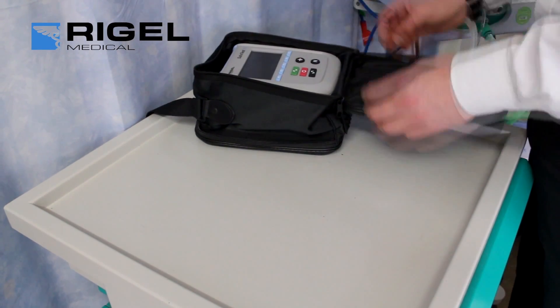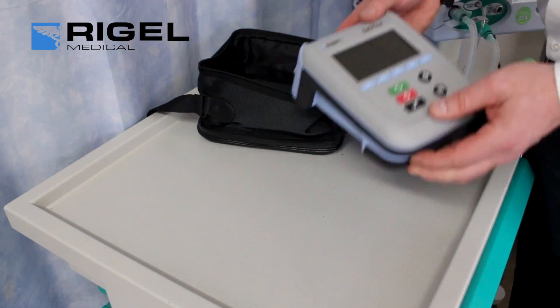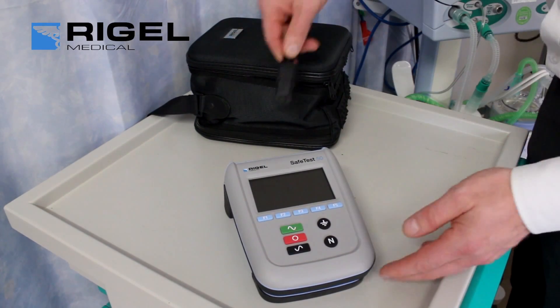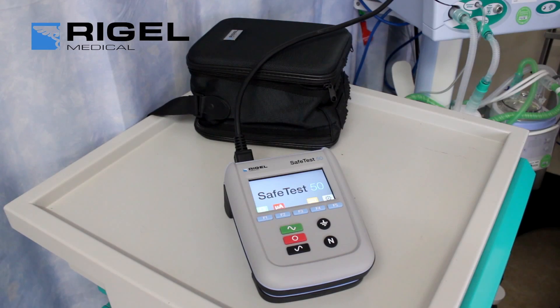The SafeTest 50 from Rigel Medical is an entry-level safety analyzer. It is designed for testing medical devices that do not require patient-lead testing, as well as laboratory equipment, in accordance with international safety standards.